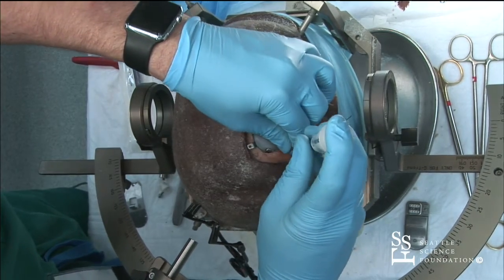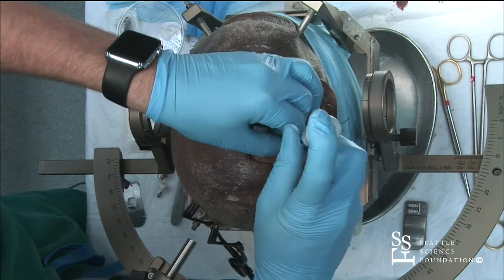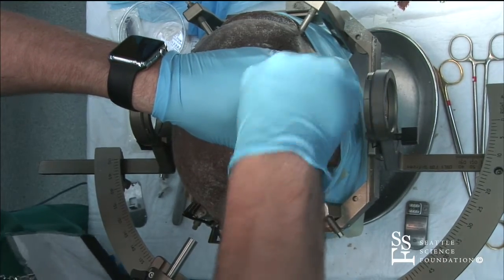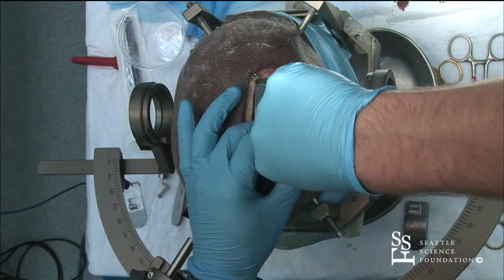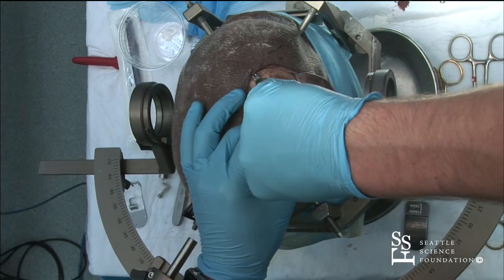So again, having all 4 tabs sit flat can be a challenge, and oftentimes you're using like a 4mm ball to go around the edges of the craniectomy so that it will sit fully flat against the dura. If there's anything off, then this ferrule won't sit flat.